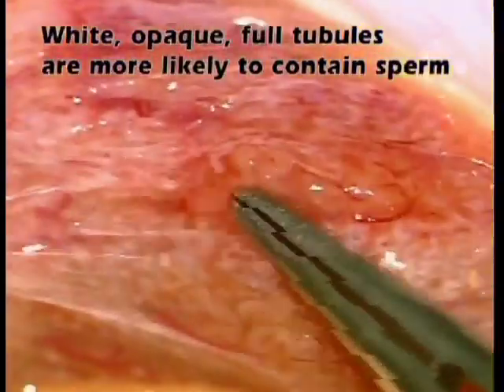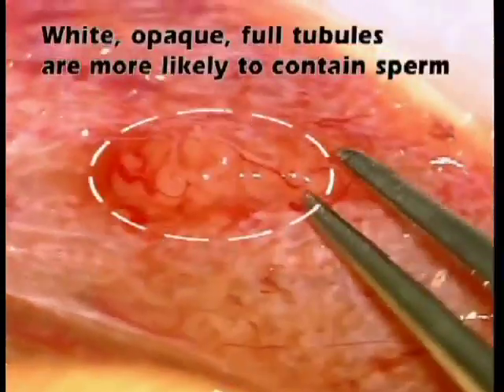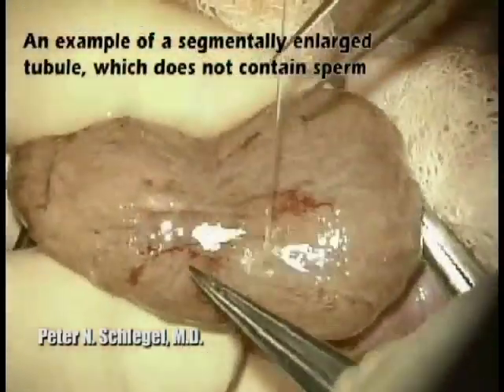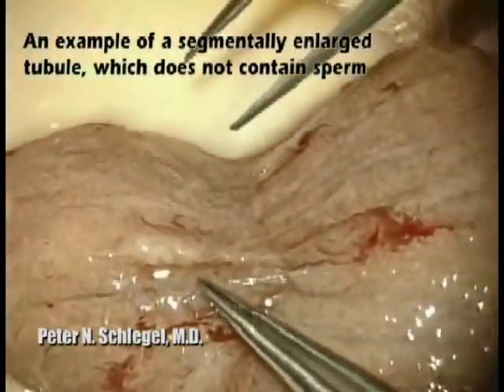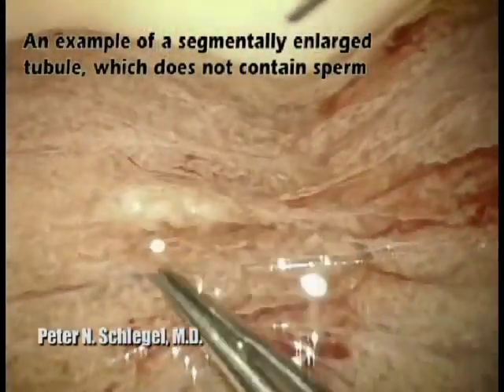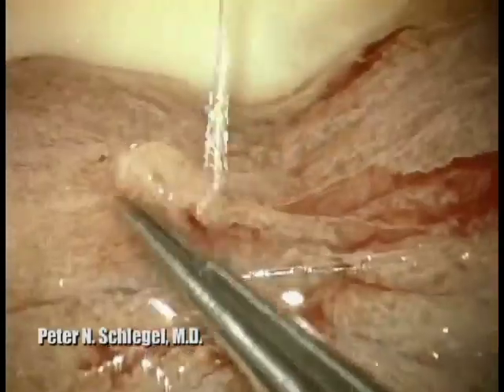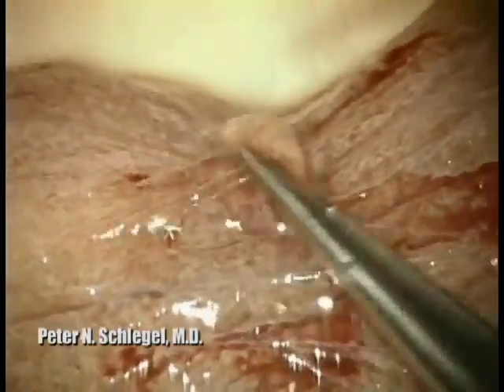White, opaque, full tubules are more likely to contain sperm. However, in some cases, an enlarged tubule may just contain germ cells and does not contain sperm. Tubules that are removed are processed and examined intraoperatively by an embryologist for the presence of sperm.